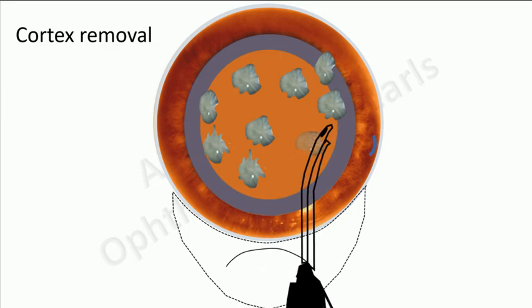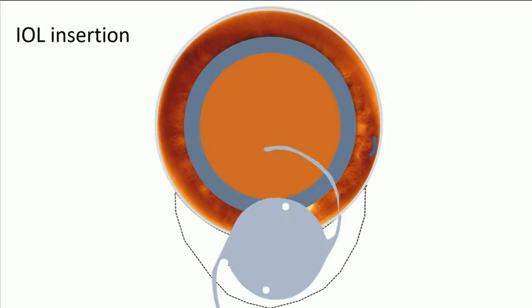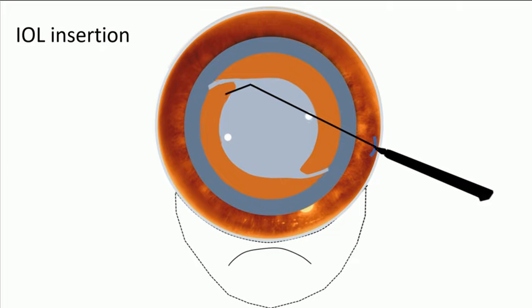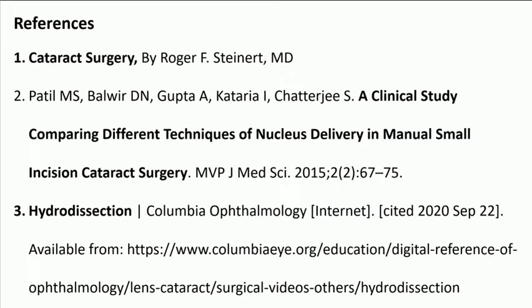The cortex is then removed with the help of a Simcoe irrigation aspiration cannula while simultaneous irrigation is done with BSS. Viscoelastic is then injected and a posterior chamber intraocular lens is placed in the capsular bag and rotated into place with the help of a Sinskey hook. Viscoelastic is removed, the side port is closed by stromal hydration and the conjunctiva is reapposed with the help of a bipolar cautery. An antibiotic and steroid is injected subconjunctivally.